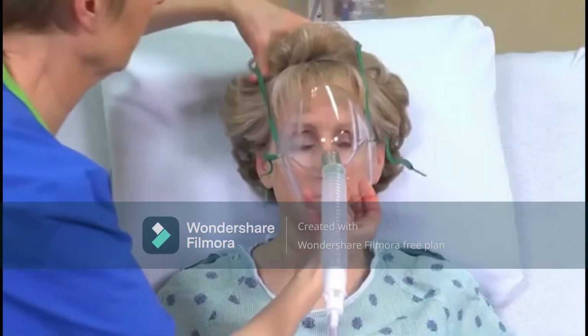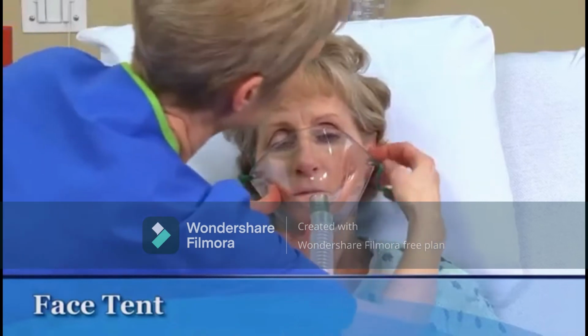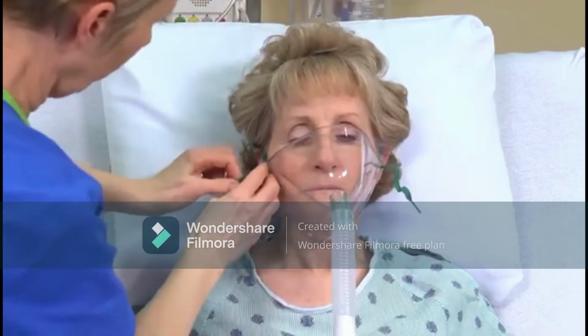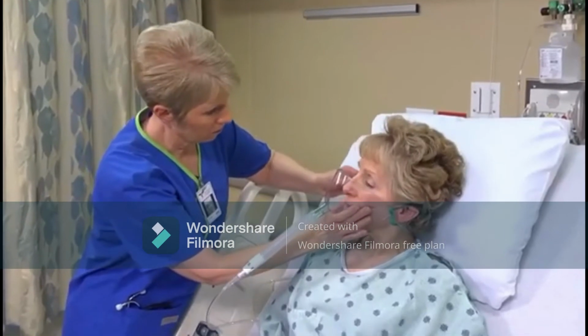A face tent is positioned loosely under the patient's chin and over her mouth and nose. The tent delivers humidified oxygen at a flow rate of up to 12 liters per minute. Because a tent lacks the tight seal that a mask offers, however, much of the mist escapes into the environment.